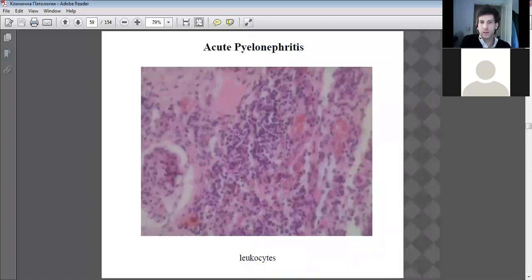Here's a better magnified view of the acute white cells, and here, like I said, there's the inflammation, all in this area where there's lots of accumulation. So let's see if we can find our leukocytes. Okay, so here's a leukocyte. Sorry, beg your pardon. Here's a macrophage. There's a macrophage there.